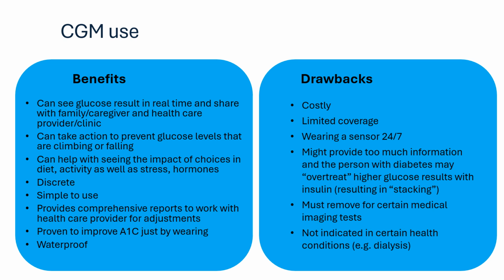So I actually advise people when they're first wearing them to do a glucose challenge. Go to the buffet, see what your normal choices at the buffet are going to do to your glucose levels. Then you can make adjustments from there. They don't know what it does because they're not continually poking their finger for it. So this is great information for them.